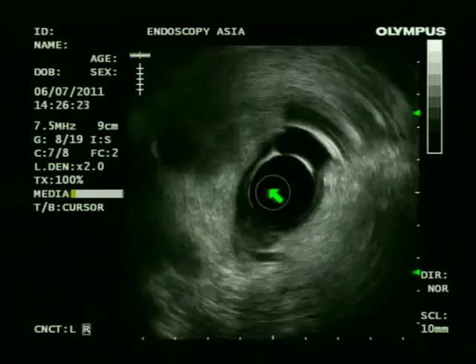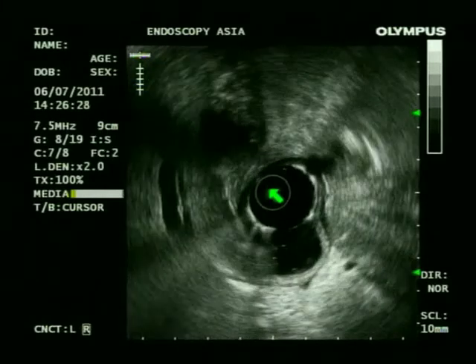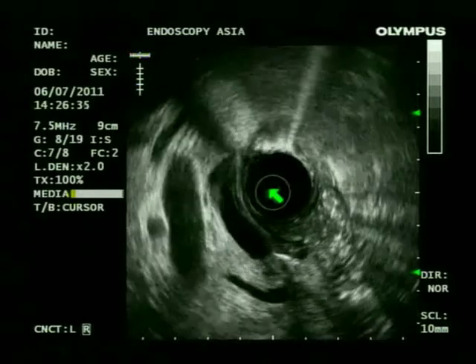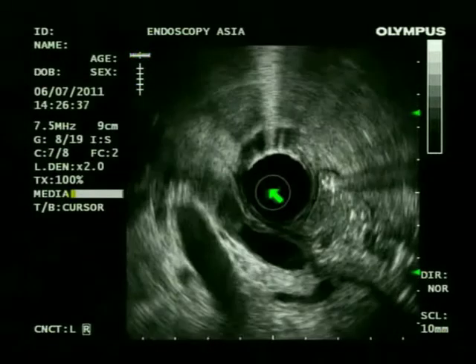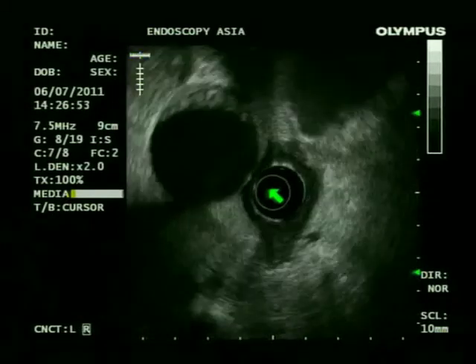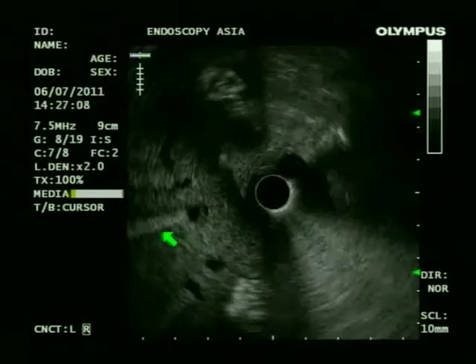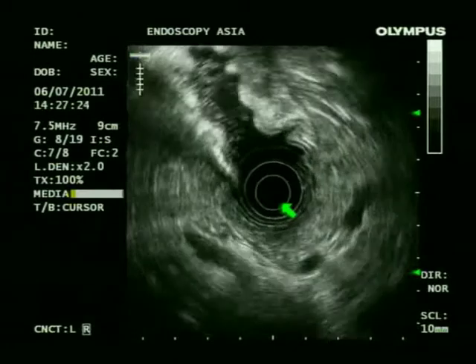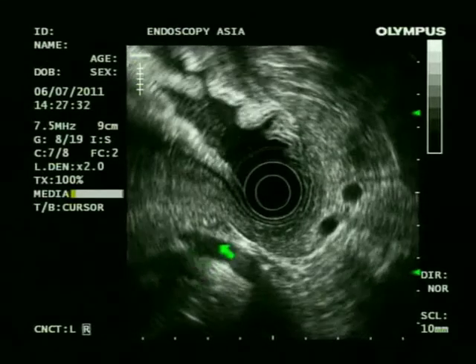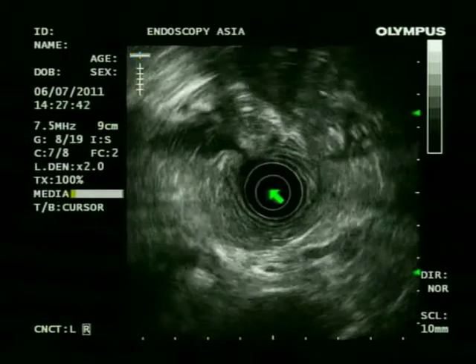You can see the part of the tumor, and now you can see the gallbladder with microliths and some sludge. You can see some cholesterosis changes. Again, you are seeing the tumor in the bile duct, lower CBD up to the ampulla. So careful evaluation of gallbladder is being done. We are gently withdrawing the scope and evaluating the part of the bile duct from the stomach now.